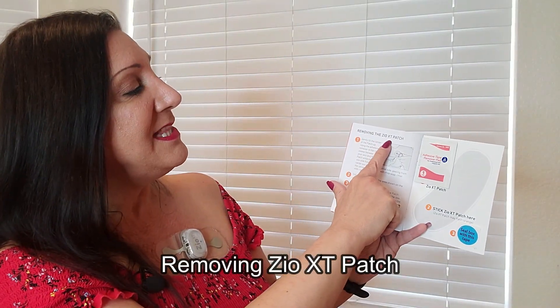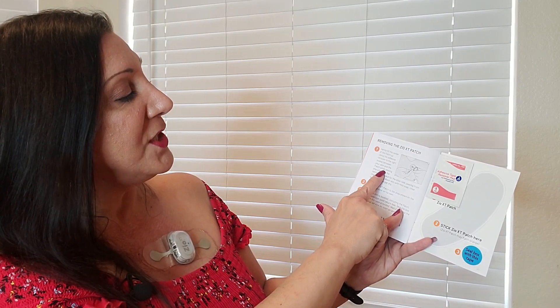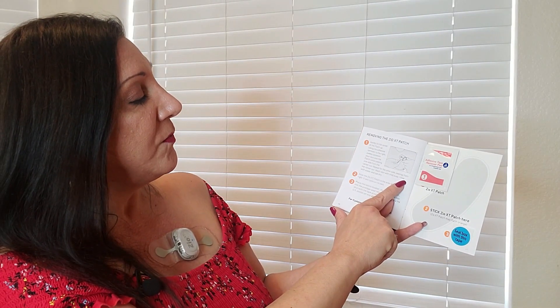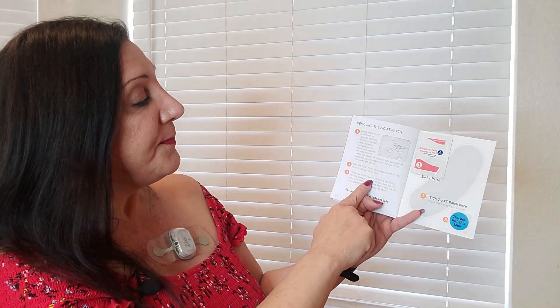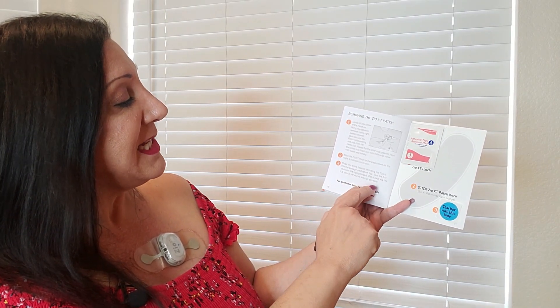At the back of the booklet it explains removing the Zio XT patch. Gently tilt the center of the patch up using the adhesive remover. Sweep between your skin and the patch while peeling one side from the center out, then repeat for the other side. Wash skin with mild soap, rinse with water, and pat dry. Stick the Zio XT patch to the area shown in the booklet — it will stick on its own. Place the entire booklet, including the patch, into the postage paid return box, seal it with the tape provided, and mail via the U.S. Postal Service as soon as possible.